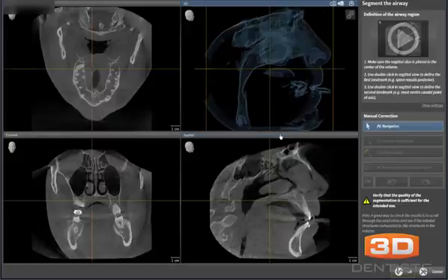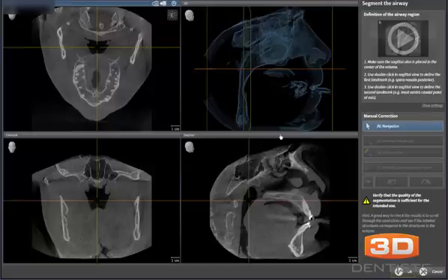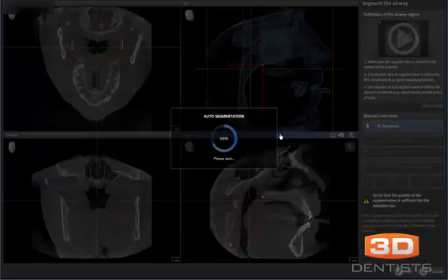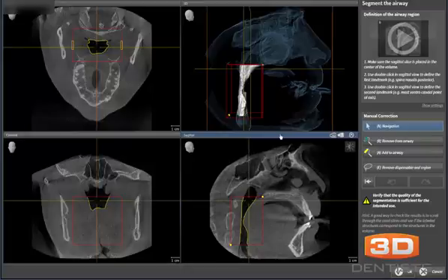One of the things you want to do is be centered in the airway. I'll double click here and get myself relatively close to being centered in the airway. We want to have bony reference points, so I'll double click on the end of the hard palate here and double click on a vertebra there. I want to remember which vertebra I use so that when we do comparisons, we'll be comparing the same volumetric size of the airway. Now the software will go ahead and auto-segment the airway. In a future video, we'll show you how to adjust the segmentation if it misses part of it or adds too much.